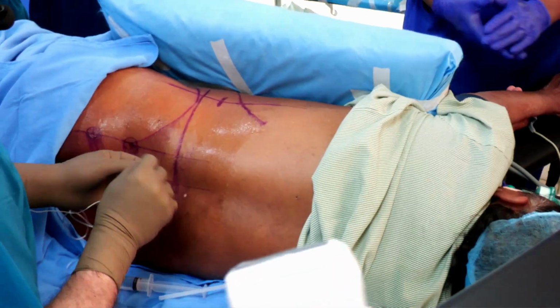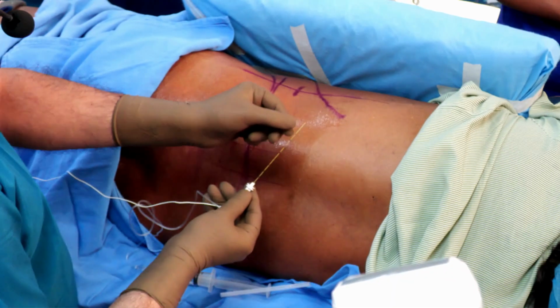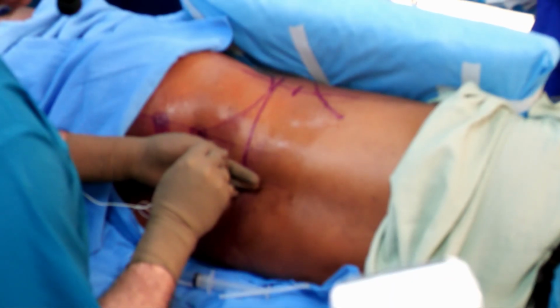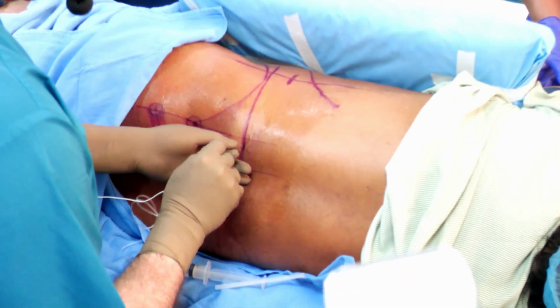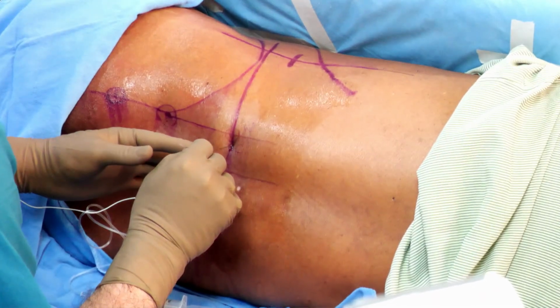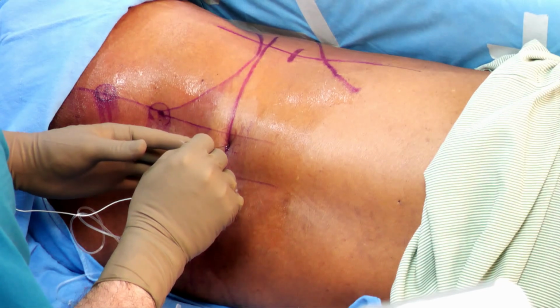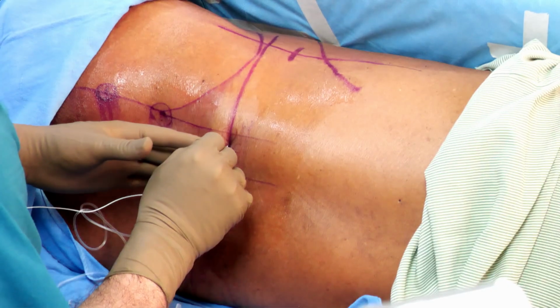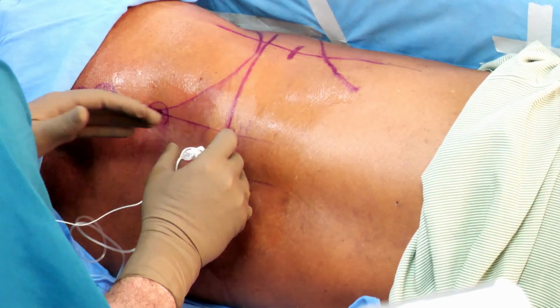So this is the Pajunk needle. It's a hyperechoic needle. I call it a hyperechoic needle. This is a Nanoline. This is inserted at Capdevilla's point. It's a bit of a blunt needle, so you have to progress very slowly, advance very slowly, and try to contact the transverse process. Sometimes you walk into the lumbar plexus. That is a possibility.